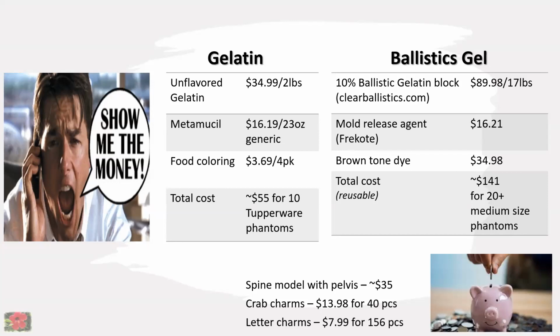So I think one of our initial posters who posted about how they use the Halloween skeleton and sponge for lungs for demonstrating B-lines and consolidation unfortunately jumped off, but it sounds like it's an option. I do have a colleague who bought a whole model skeleton off Amazon and has used many different pieces of it in ballistics gel in his garage. I think a John Deere tractor might have been involved as well. So lots of great options and possibilities. All right, any other questions about phantoms?